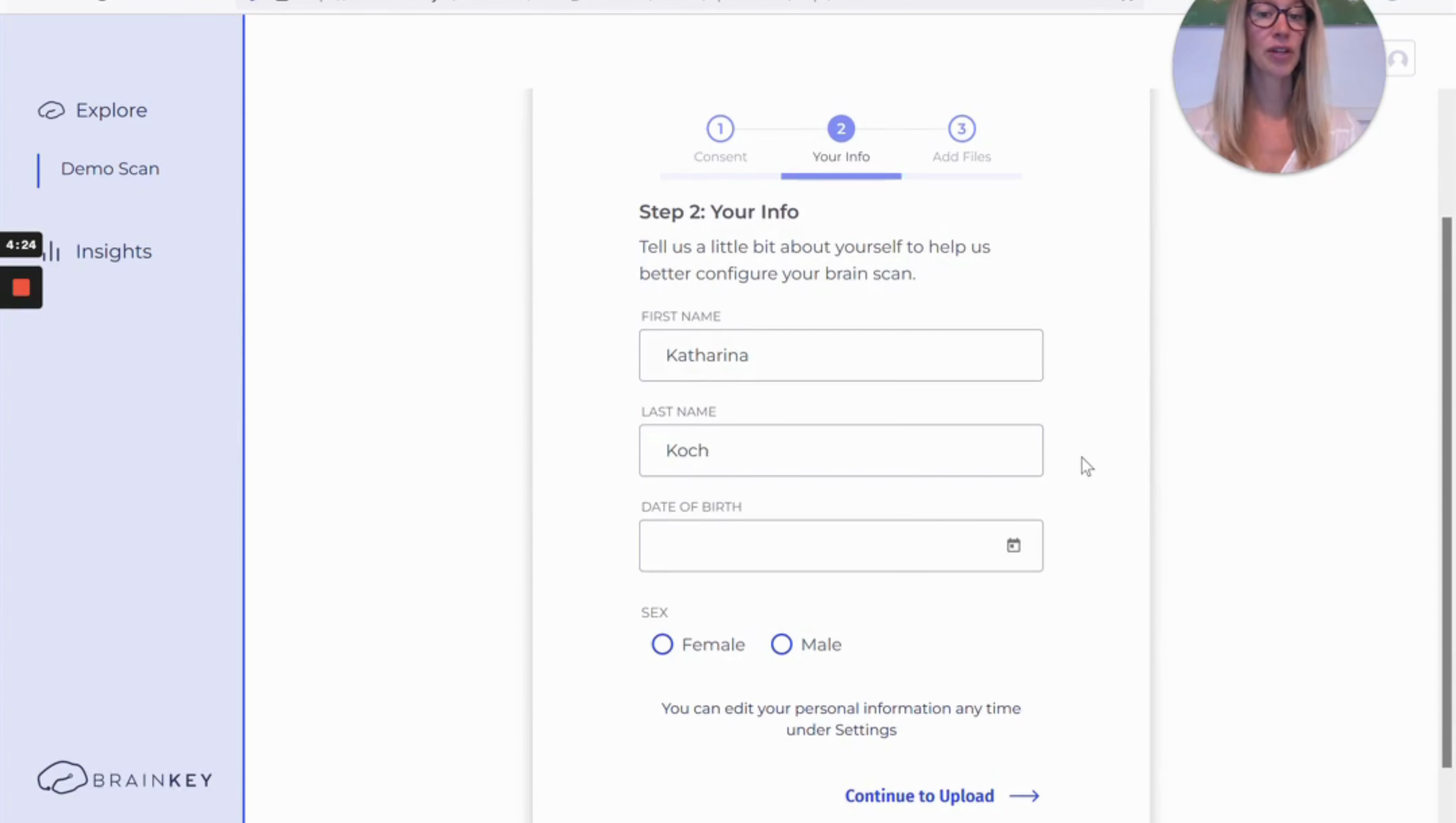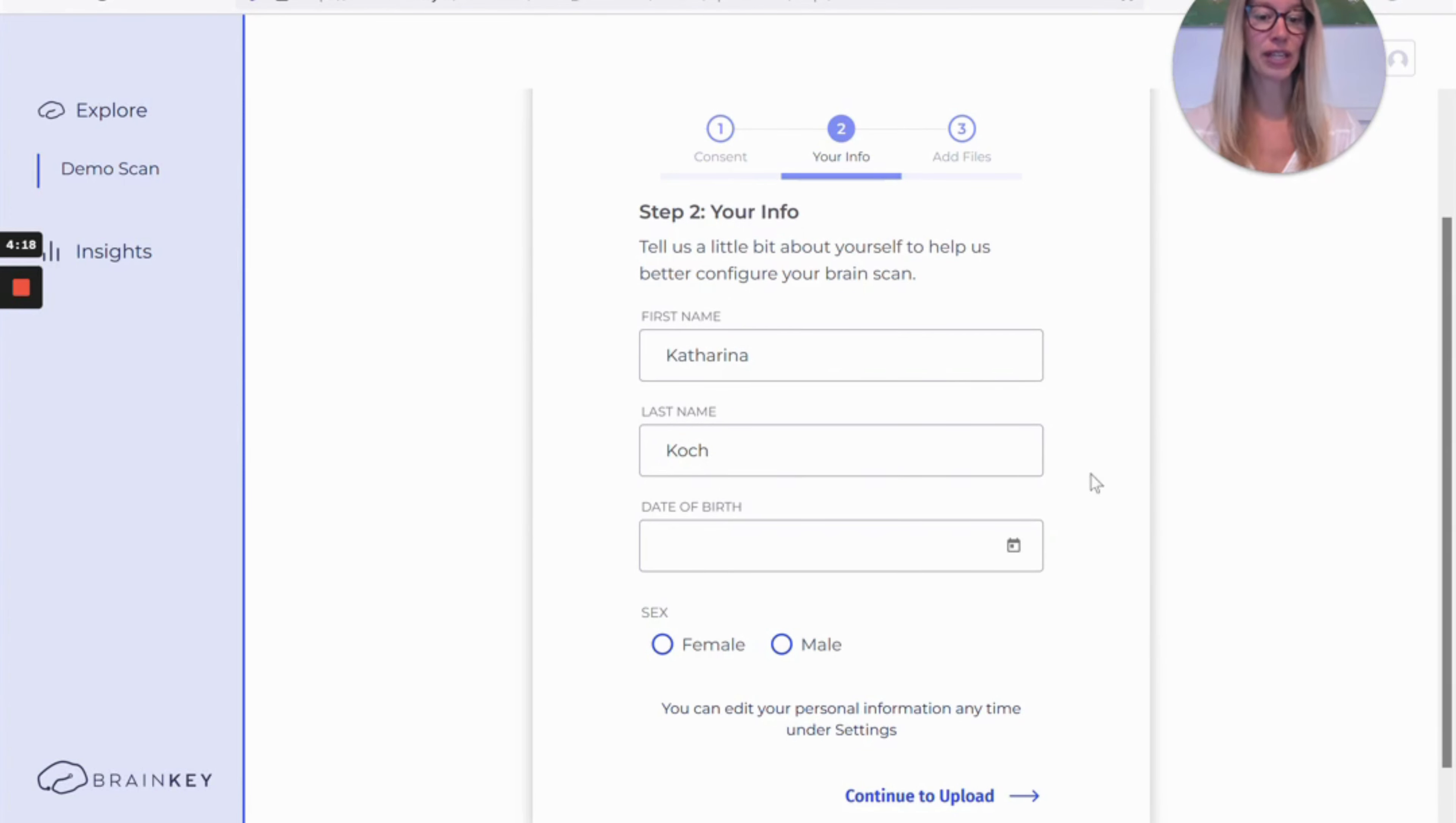Next you're going to be asked to provide some more information about yourself. You can always update this information later in your settings.